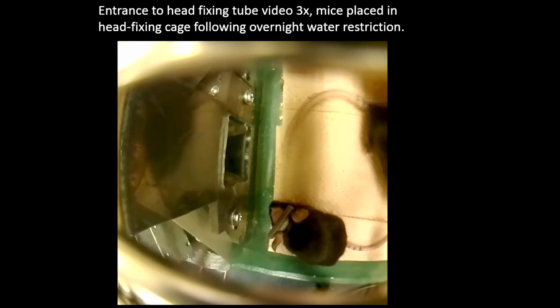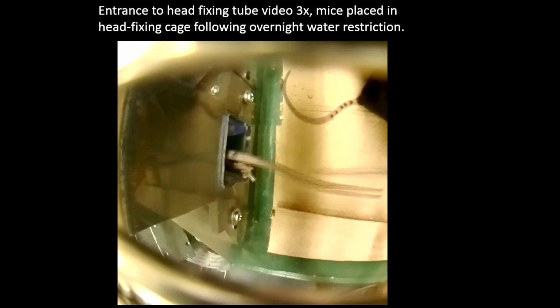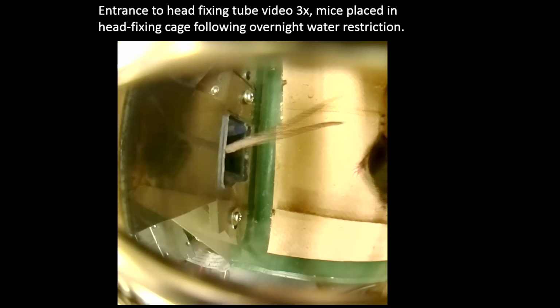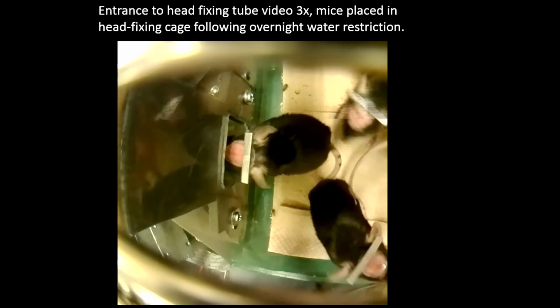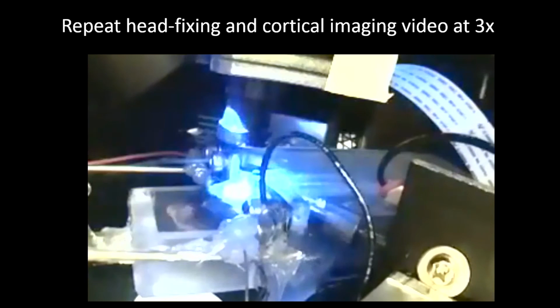I'll skip forward. So this is sped up, but just showing the mice in the cage, goes in, gets head fixed, and then it will come out. In this case, it's only being imaged for 30 seconds. It can be longer. It's going to come out. Let's see. There it goes. And then some other mice will look into it, possibly go in. So here's a different perspective, mouse getting head fixed and getting water, of course.